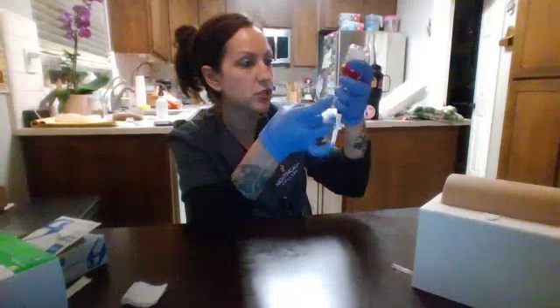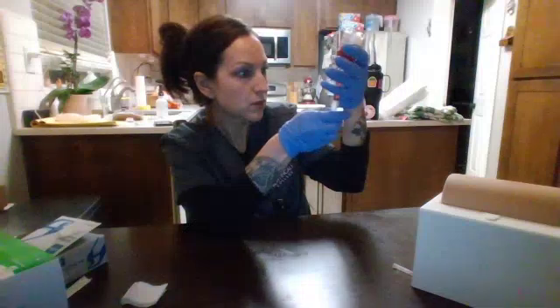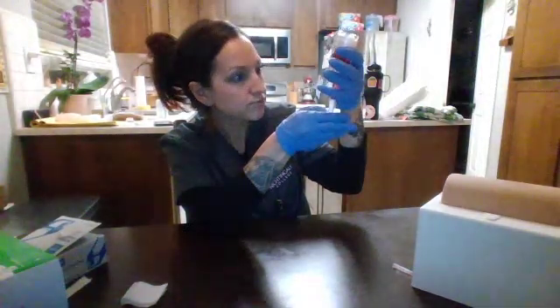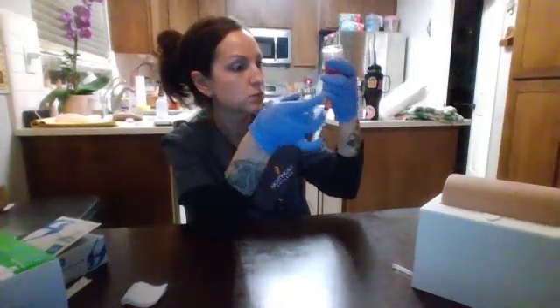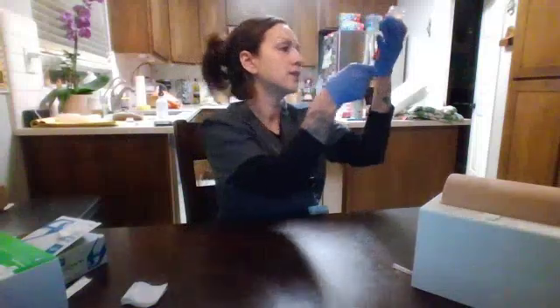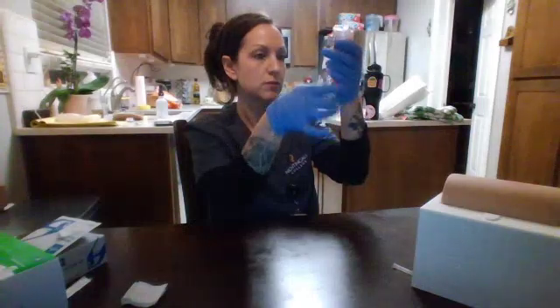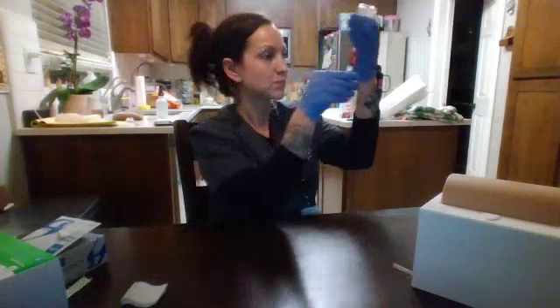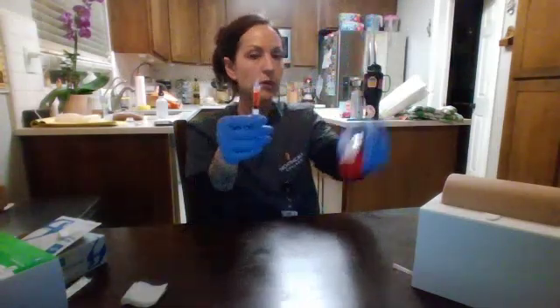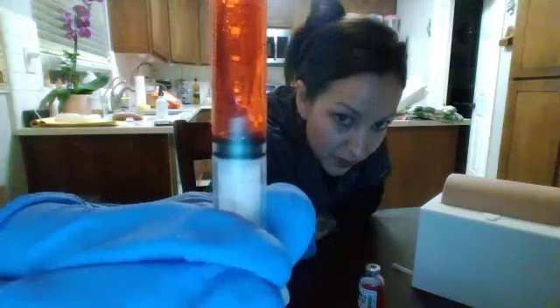Now I'm going to make sure that there's no bubbles. All right, and we are at 1.5. All right, so 1.5 mLs.